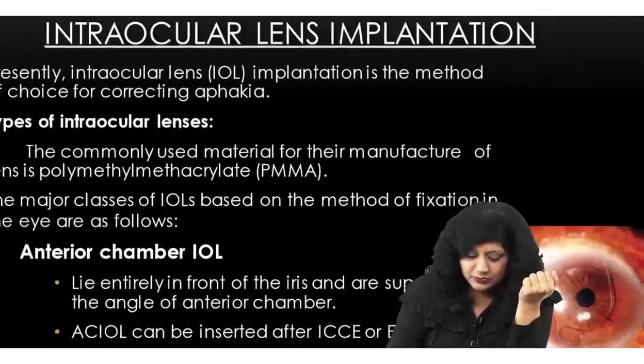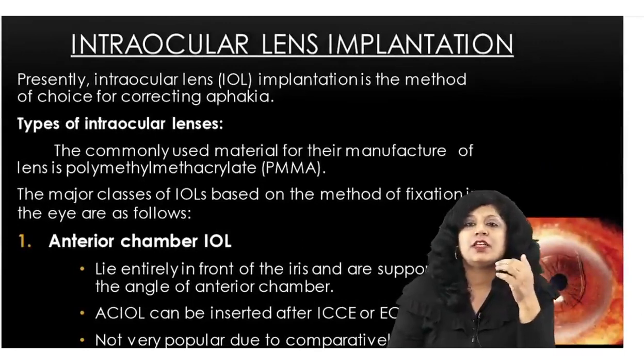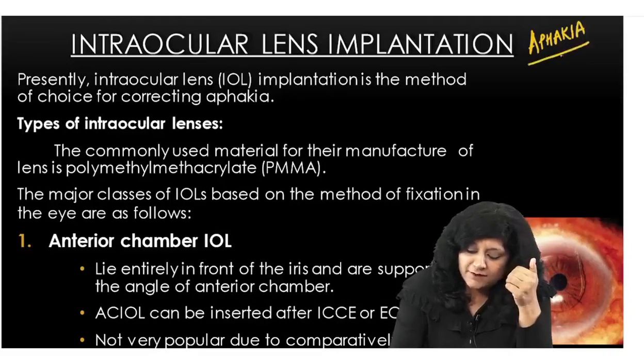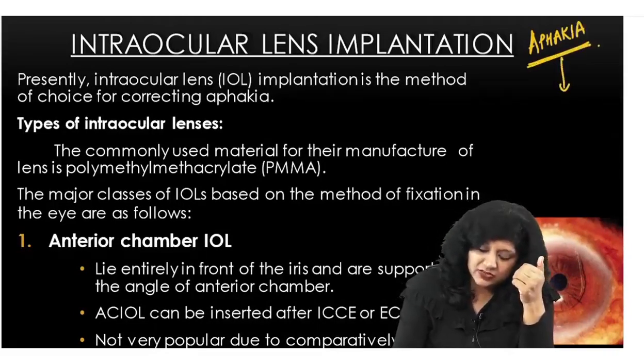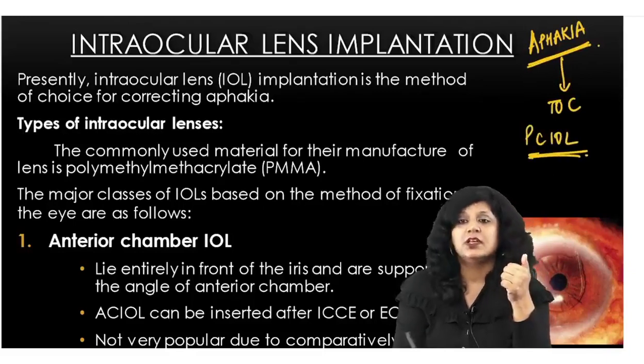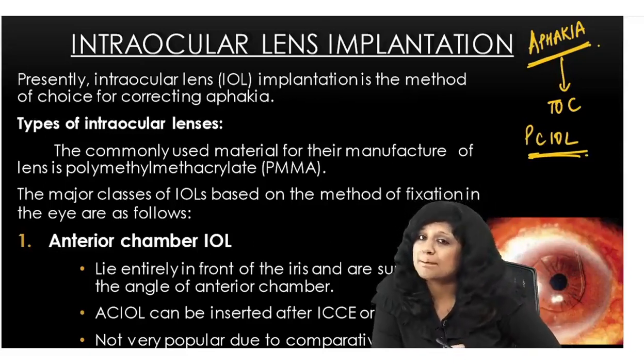Now, a few words about intraocular lens implantation. When you are doing the cataract extraction, what is created is aphakia. Aphakia is created, and the treatment of choice for aphakia nowadays is PCIOL implantation. PCIOL means posterior chamber IOL implantation.